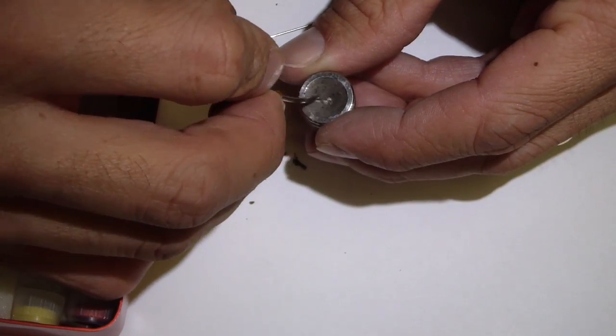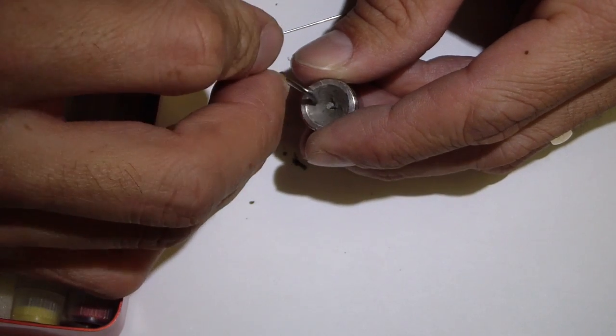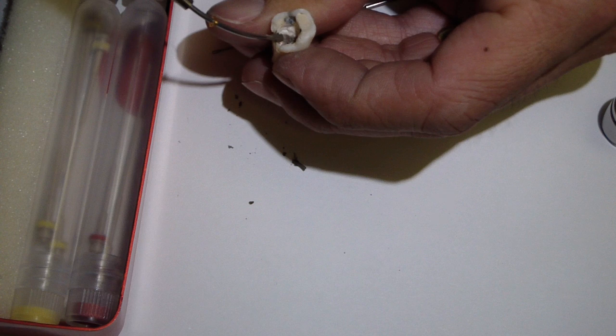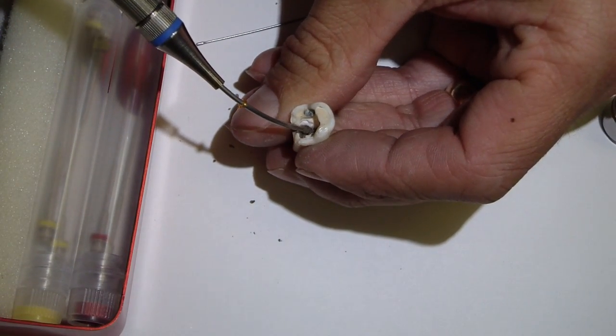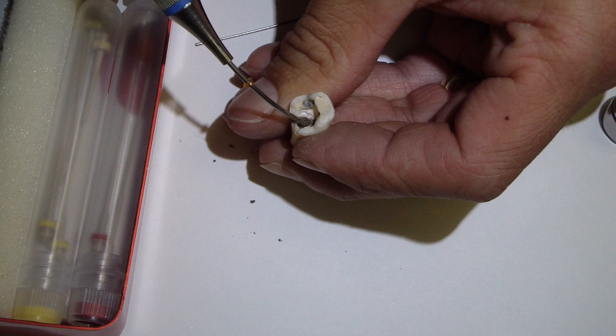That should be sufficient. Now we're going to make sure we get that in the shot. Just place it into the perforation. There we go.